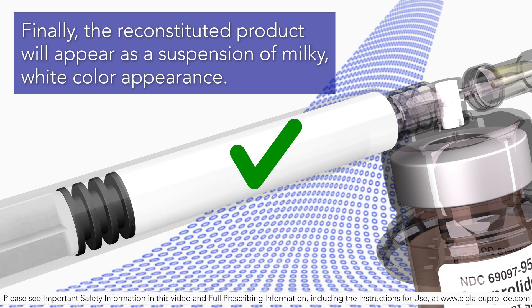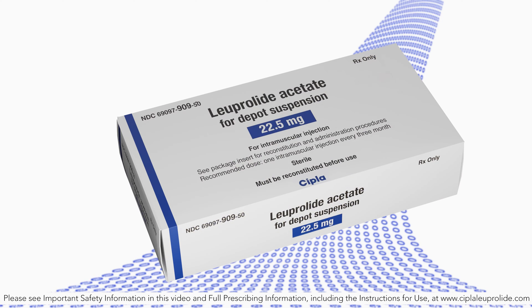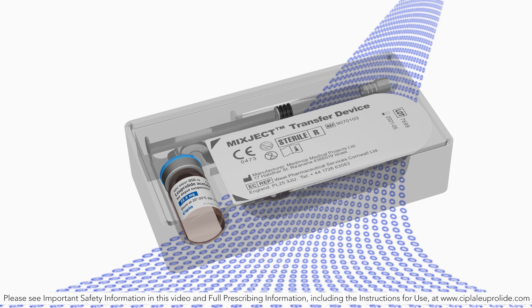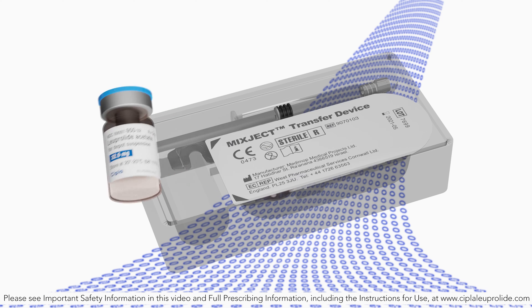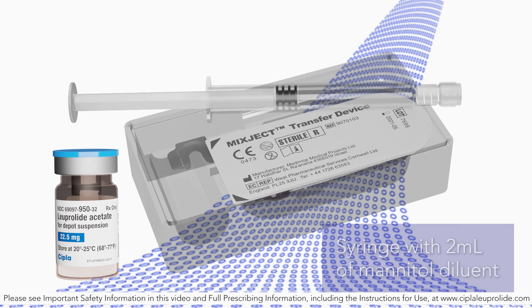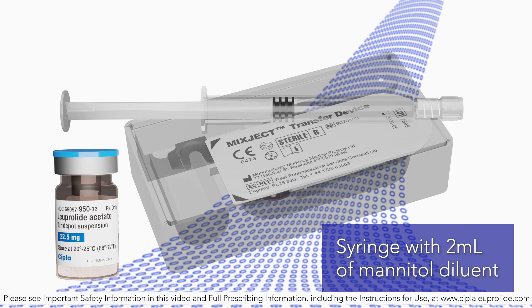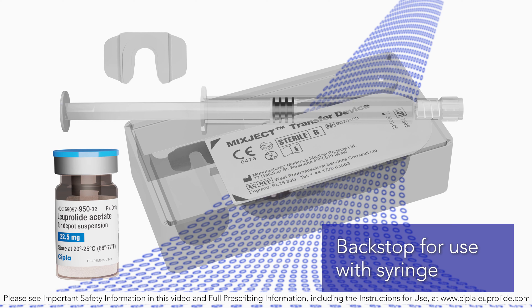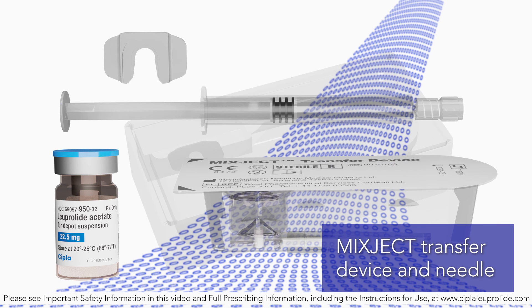Finally, the reconstituted product will appear as a suspension of milky white color. Leuprolide acetate injection depot is packaged in a commercial kit. Each kit contains: one vial containing 22.5 milligrams of leuprolide acetate as lyophilized microspheres, one pre-filled syringe containing 2 milliliters of mannitol for injection, one backstop for use with the syringe, and one MIXJECT transfer device including one needle.